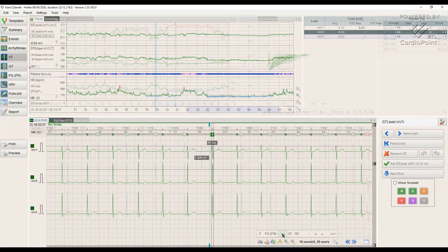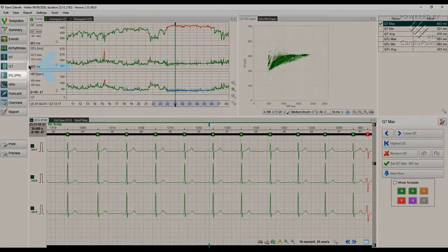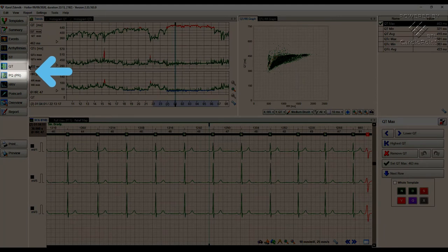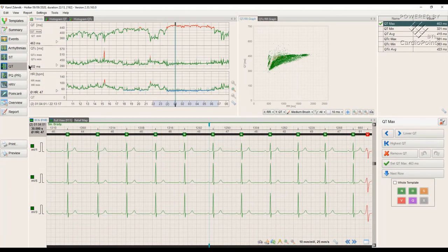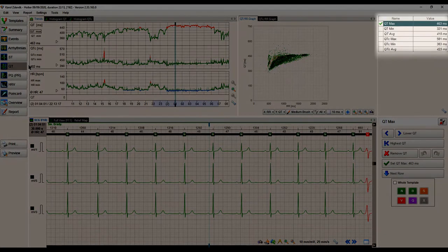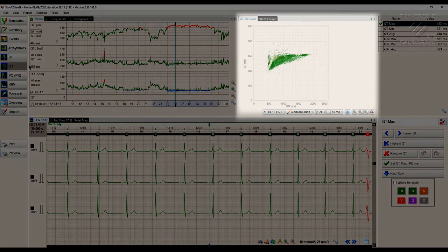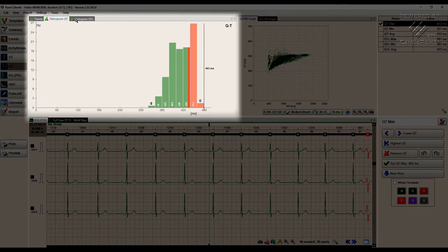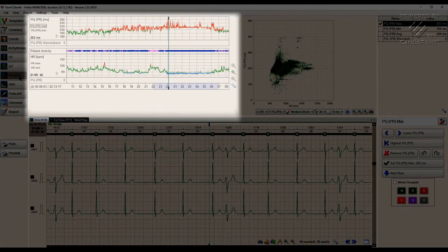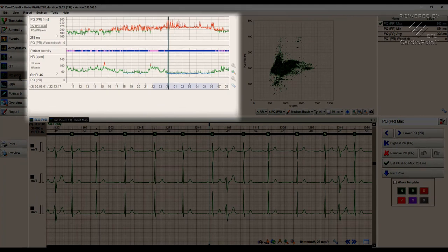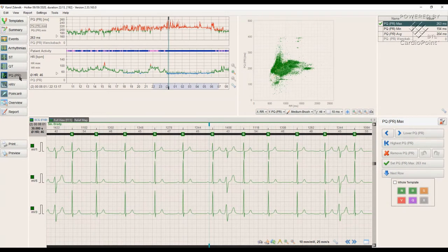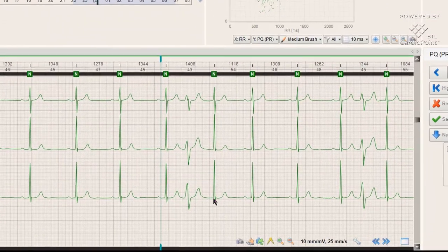Now let's take a closer look at QT and PQ PR modules. Same as in the ST module, the BTL CardioPoint Holter provides automatic analysis of QT and PQ PR intervals in various forms: tabular data, scattergrams, histograms and trend components along with the heart rate graph and ECG view.